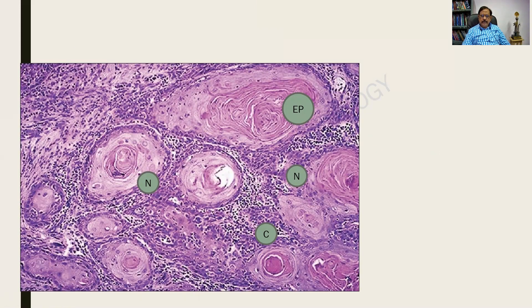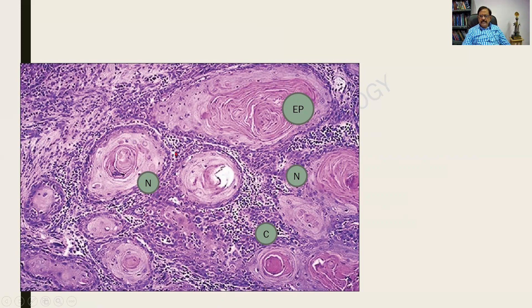Let us look at the microscopic pictures. This is a microscopic picture of squamous cell carcinoma — the moment you see it, you can make a diagnosis. These are all nests of epithelial cells — a nest of tumor cells concentrically arranged around each other, forming what is called an epithelial pearl. Epithelial pearl is classical of squamous cell carcinoma. Pearl is actually a secretion formed by the oyster; as more and more secretions are deposited, they harden into a beautiful jewel. Sometimes the nests can be long cord-like structures. The supporting stroma contains all the blue dots, which are inflammatory lymphocytes.